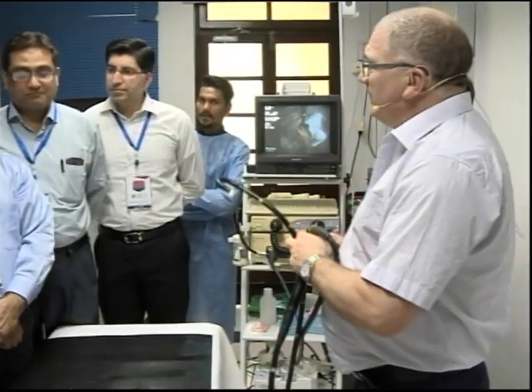Now, there are certain terms that I don't like. Push is one. I'm going to push this tube up your bottom. I'm going to advance this tube up your bottom. What's the difference between push and advance? Push is when you have some resistance and you're trying to overcome that. Advance is when you're going and advancing. You know where you have to go, so you're just going. But push is basically a term that should not be used in endoscopy. We discourage that because if you don't push, you don't perforate.